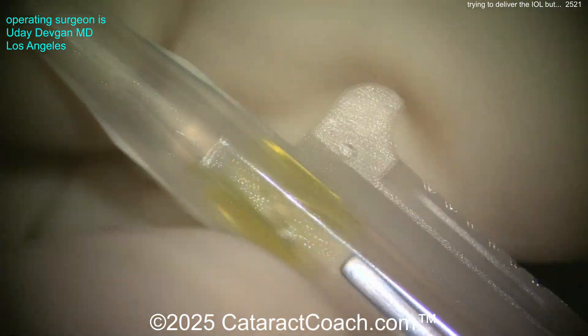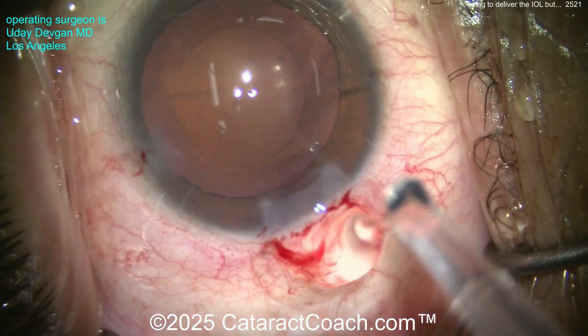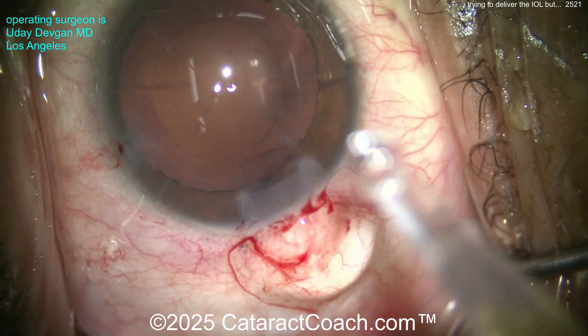You can see we're using the C cartridge to load it, not the D cartridge. The D cartridge is the normal one for lens powers under 28 diopters, but once you get past 28 diopters the lens optic becomes too thick, so we need the C cartridge.